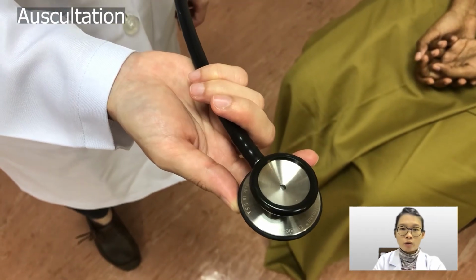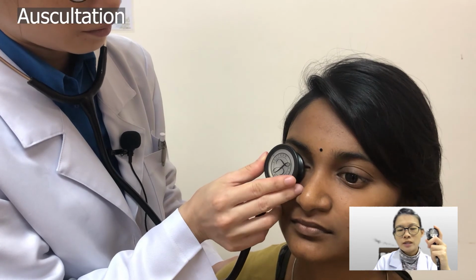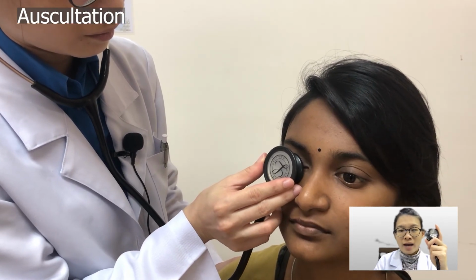When listening for an orbital bruit, use the bell to auscultate the eye globe. To eliminate the noise of the eyelid muscular contractions, instruct the patients to open both of her eyes and gaze at a distant point. Then the eyelid is passively shut by using the bell of the stethoscope.